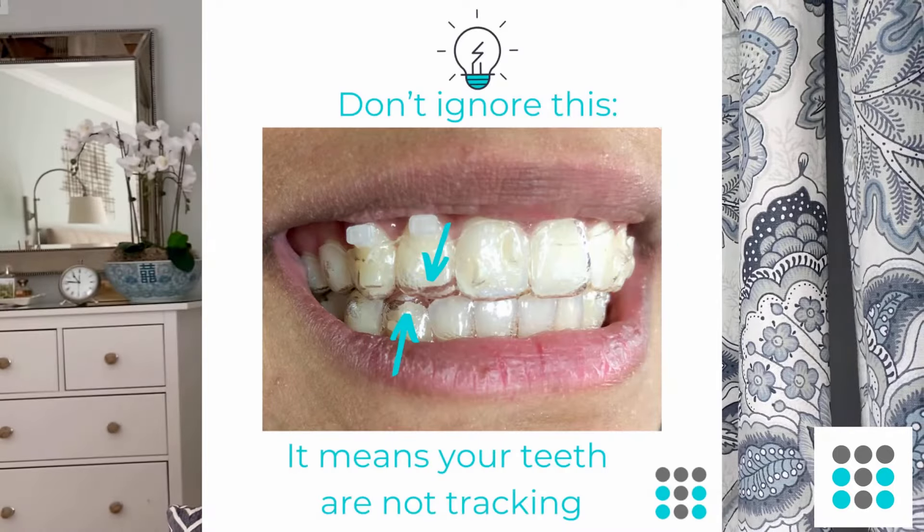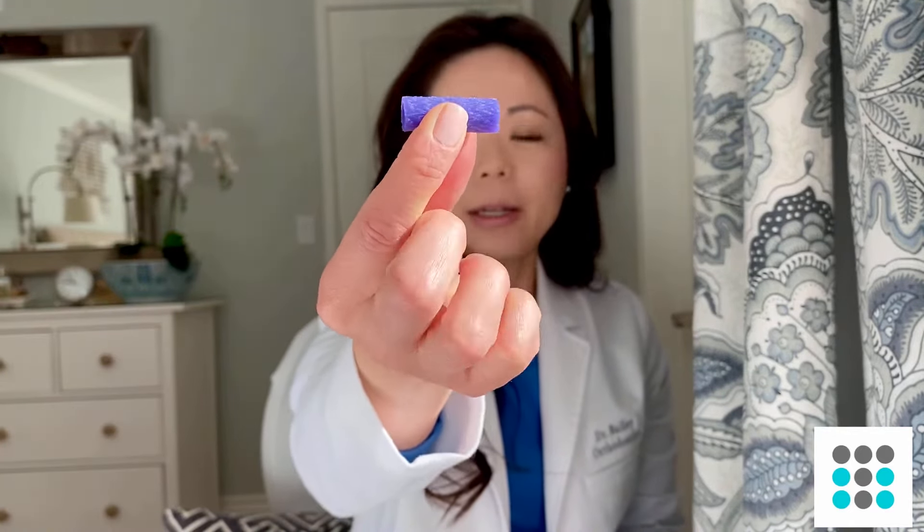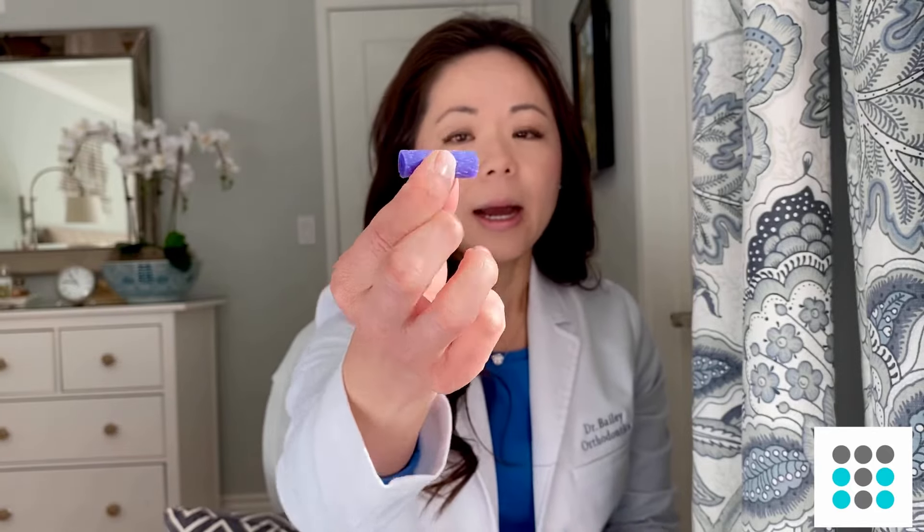In order to fully seat your aligner, you're going to have to do chewing exercises. Chewing exercises involve using some sort of a tool — the most common would be the foam roller type. Those are called chewies or munchies. They look like this — just like a foam. You can use them many, many times; just be sure to clean them thoroughly at least a few times a day and rinse them off.